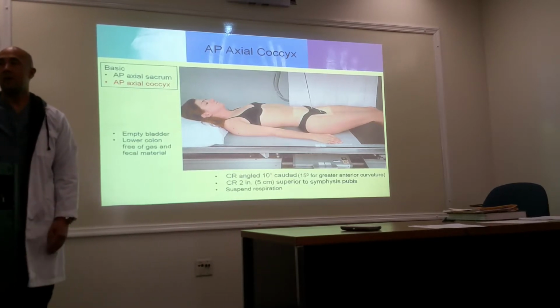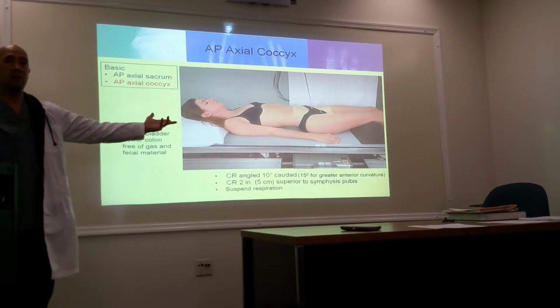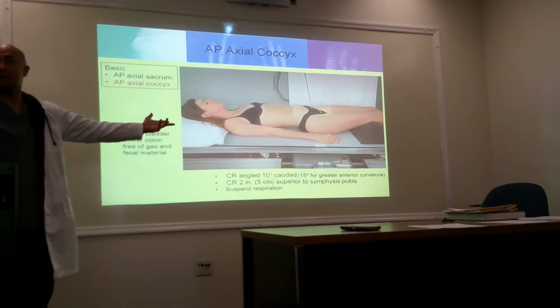Okay. Now for males, can we shield males? Obviously we can't do females, but can we shield males? Yeah. Sure. This one too, right?